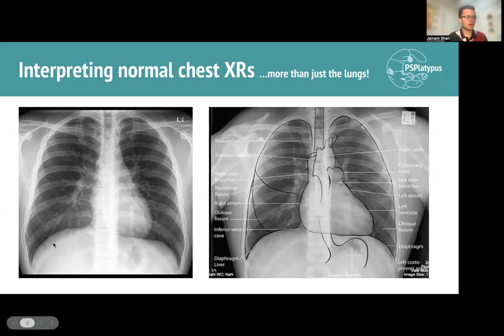Also, there's soft tissue, right? I've already discussed the lungs, but also look at the muscles. You can see the diaphragm at the bottom, with that classic dome shape to it, which we'll go over in a couple of minutes. And you've also got the trachea coming down. While you can't see the lungs themselves, you can see the trachea bifurcating into the two main bronchi and then eventually penetrating into the lungs via the hilum.